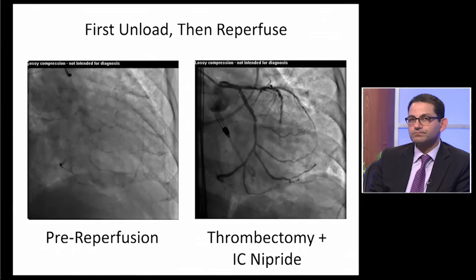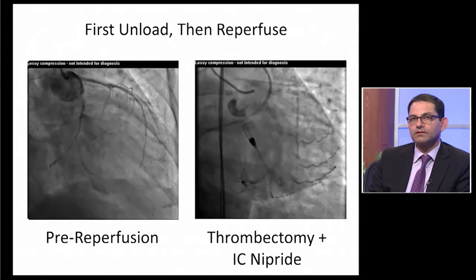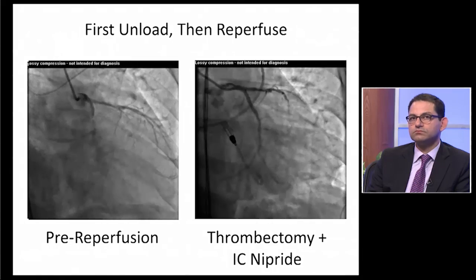I think your point about giving intracoronary vasodilators is really crucial. So you open up the artery, you've got TIMI 2 flow. That's not good enough, and so you really want to try to be aggressive. In our place, we use a lot of nicardipine and some nitroprusside, a lot of adenosine. But all of those are going to drop the blood pressure. So if you've got a blood pressure that's tenuous in the 80s, you give them something intracoronary, all of a sudden you're kind of in a pre-arrest situation. So you can be much more aggressive with the intracoronary vasodilators while they're on support.